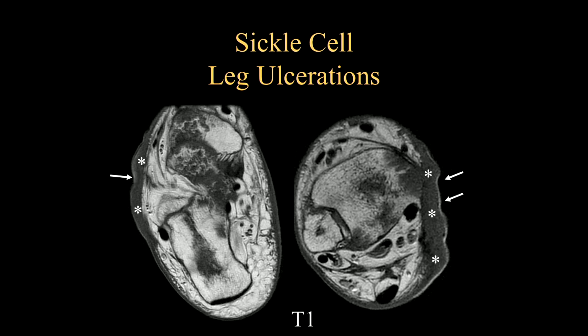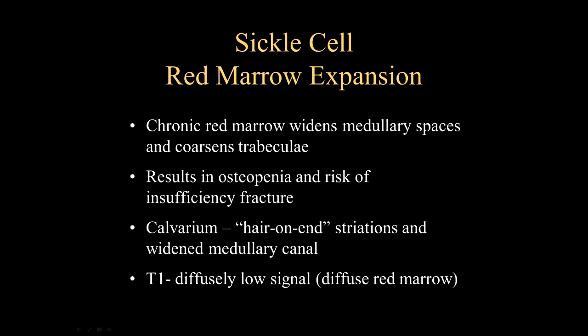Patients can also have leg ulcerations because of the soft tissue thrombosis, vasoocclusion, and the overall poor blood supply. Specifically over areas of bony prominences, leg ulcerations are more common. Also note the areas of bone infarction as well as red marrow hyperplasia throughout the remaining portion of this ankle. The calvarium can have a very classic hair-on-end appearance, although this is actually more common in thalassemia, which we're going to discuss next.